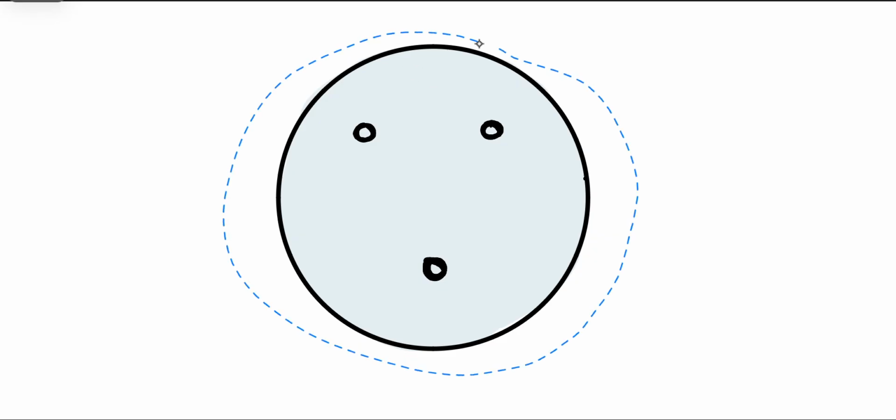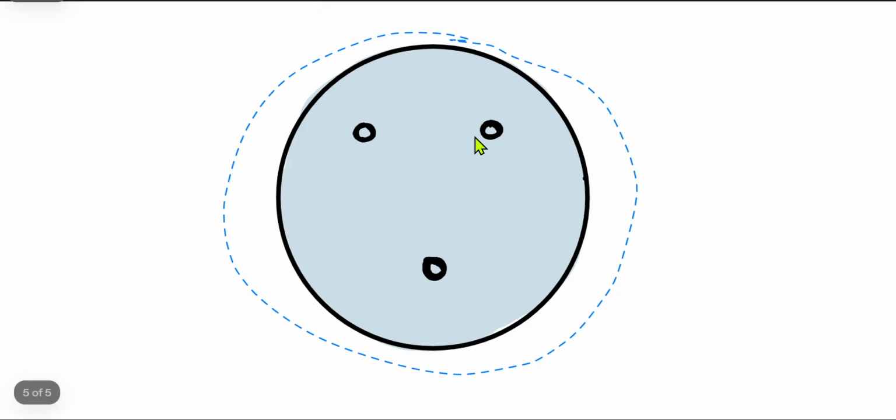Now in the protocols you have to learn how much agar is poured and all. That is what one can learn, but the concept should be very clear. So this is the pouring of agar which has been done, and approximately 5 ml of agar we are pouring. Now what do we do? We will carve out the specific holes. So let us say we have carved out 2 holes here, and then 1 hole here. Now these specific holes are for antigens, and this specific hole is for antibody. Now let me make it in duplicates because I will require it.